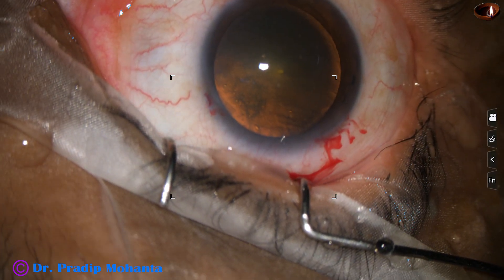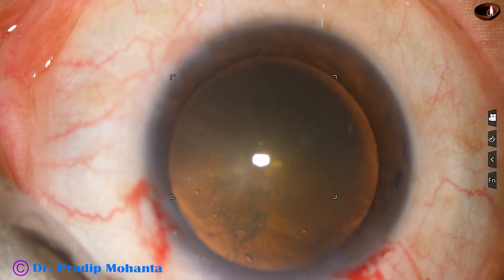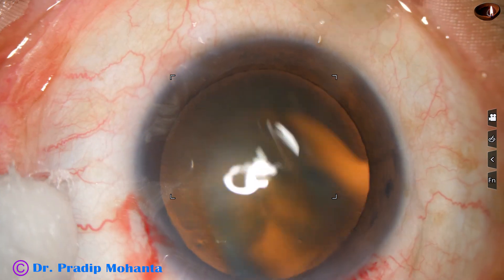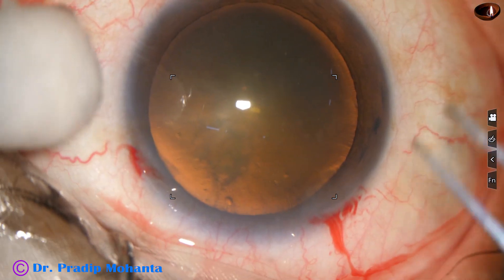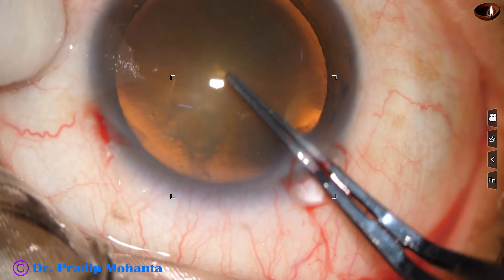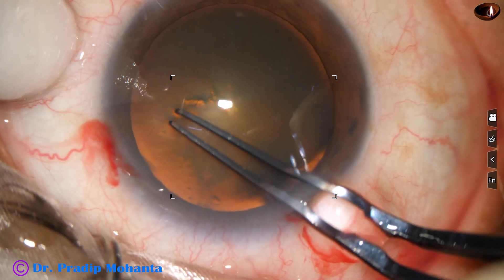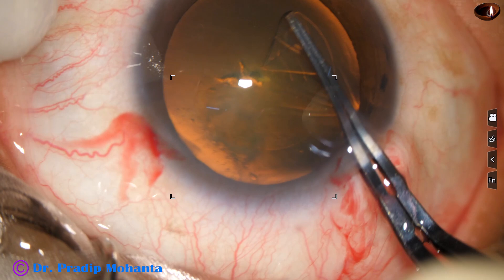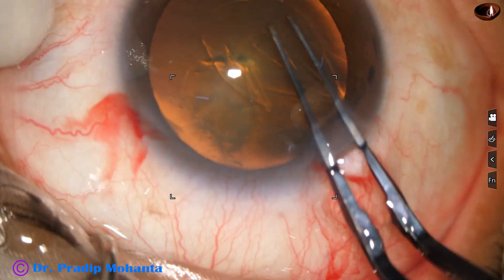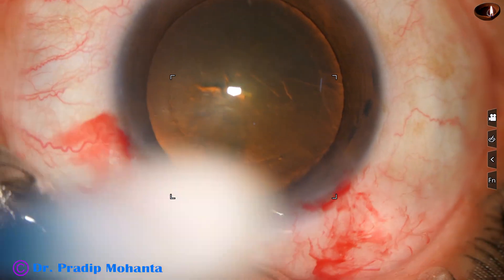And now capsulorhexis with the help of a Utrata forceps. The anterior capsule is pierced at the center. A capsular tag is raised and this capsular tag is guided anti-clockwise all around, and an adequate size rhexis of about 5.25 millimeters is done.